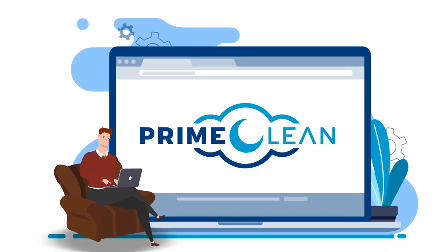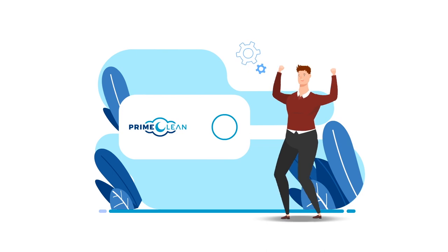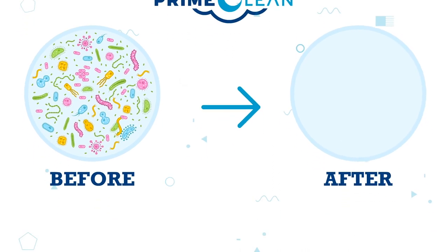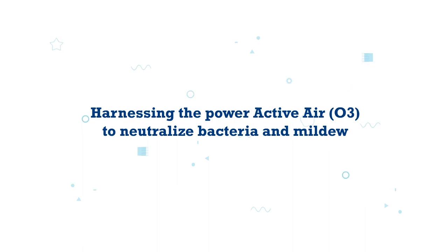This was when Matt came to know about the Prime Clean — the industry's smallest and lightest CPAP mask cleaner that cleans up to 99.9% of all germs and bacteria in your CPAP equipment by harnessing the Power Active Air O3 to neutralize bacteria and mildew.